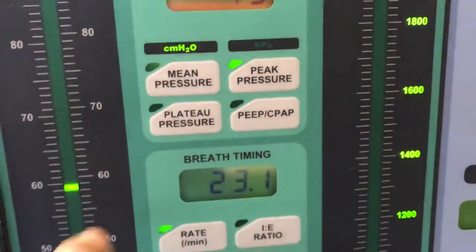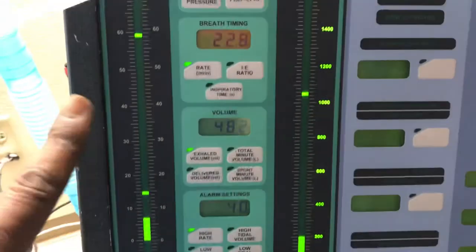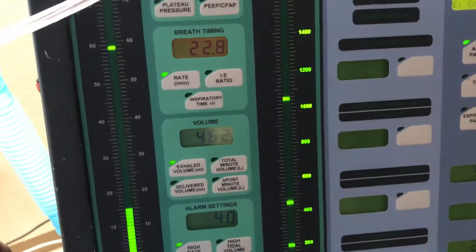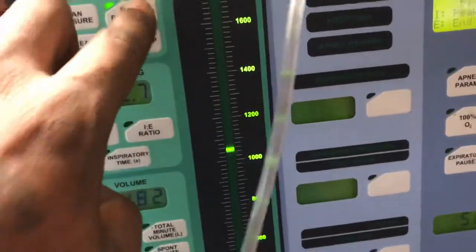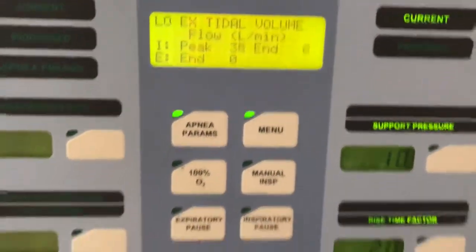We can switch to the side we want to see the mean pressure. This is the regulator or the manometer here. Going to peak pressure, we can see our peak pressures are around 15 or so.